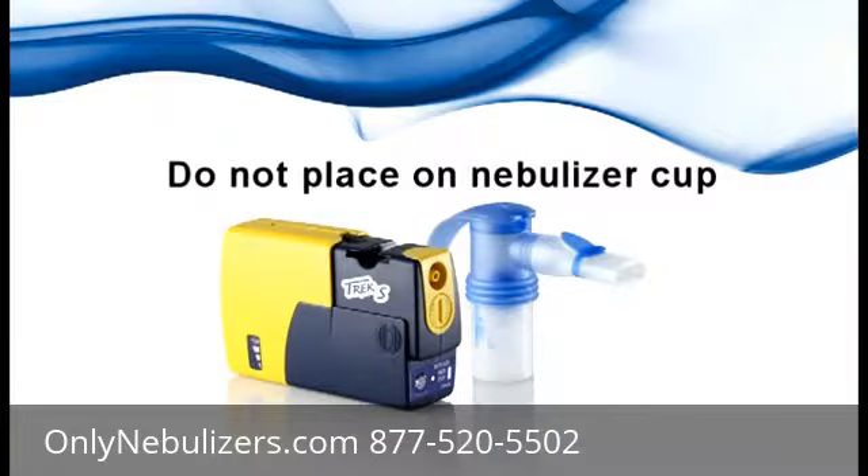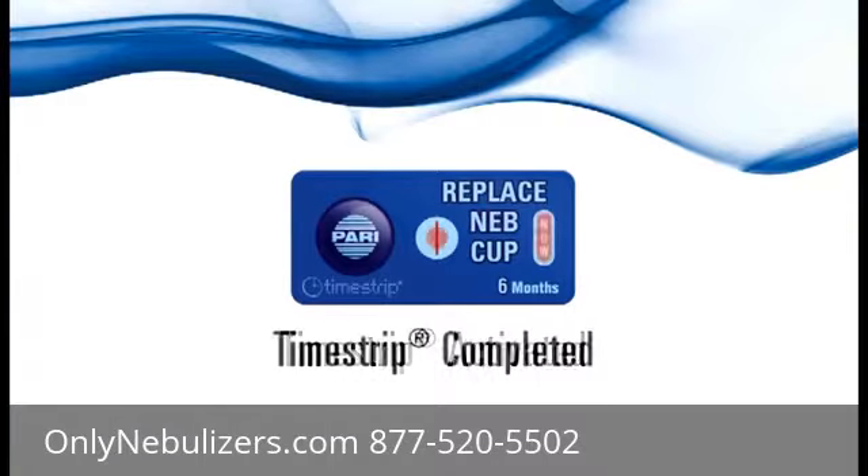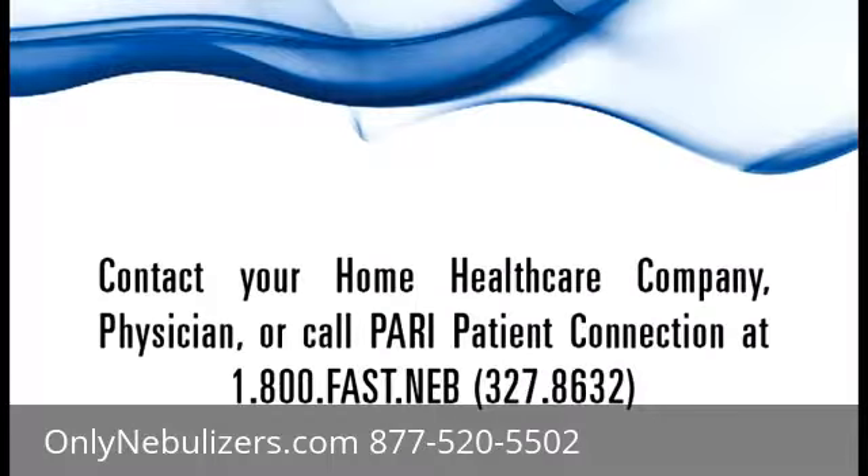Do not place the time strip on your nebulizer cup. After six months, the oval on the right-hand side of the time strip will be red and the word 'now' will appear in the window. Please contact your home health care company, pharmacy, or physician for a new Pari reusable nebulizer. Only Pari brings you this easy visual reminder for the most efficient treatments.